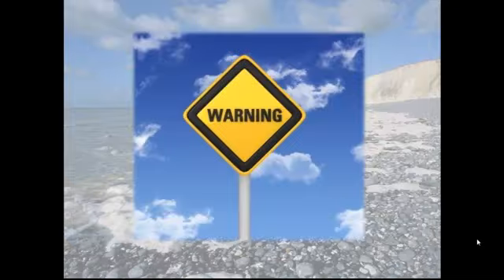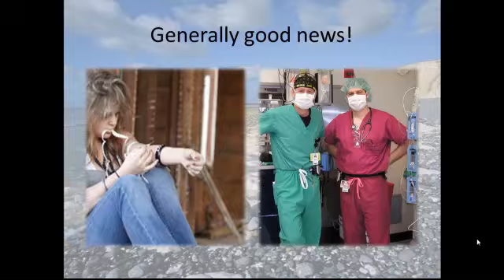So I would just restate what the first two speakers have both said, which is whenever doing an echo talk, one has to put up a health warning to say that you don't diagnose endocarditis with echocardiography. It's a fantastic tool for confirming the diagnosis and potentially identifying cases from time to time, but the diagnosis remains a clinical diagnosis backed up by microbiology.